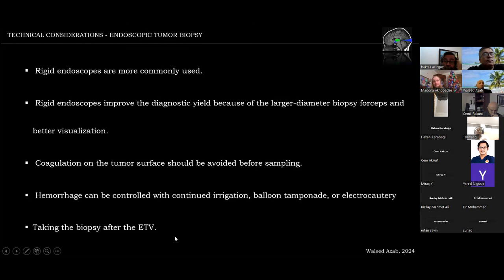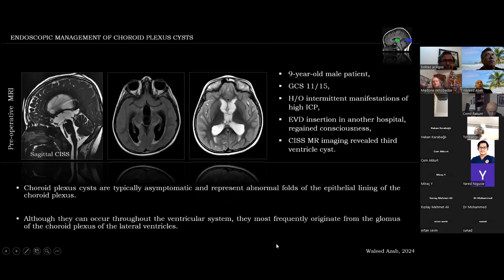One important advice: take the biopsy after having done the ETV — ETV comes first — because these patients have critical hydrocephalus that must be addressed. In some cases, if the biopsy is done first, vision will be obscured and you will not be able to have proper visualization for an ETV.